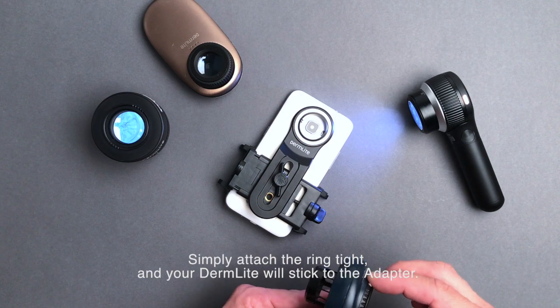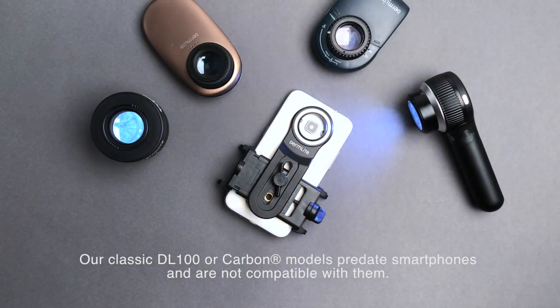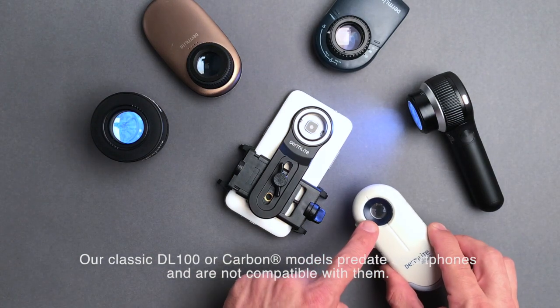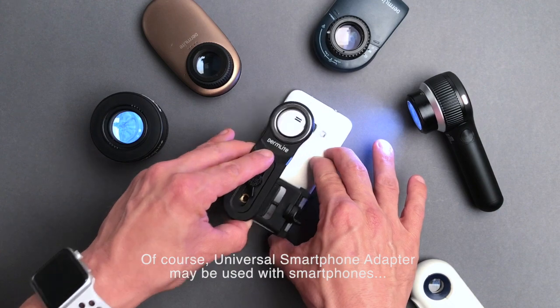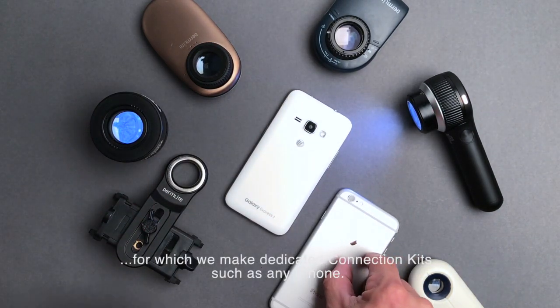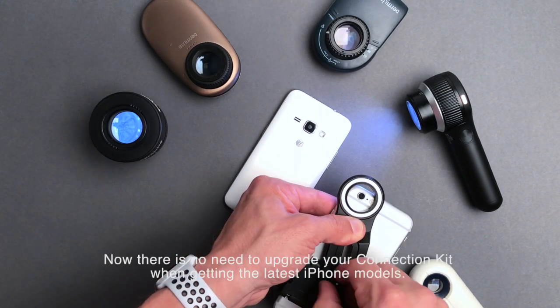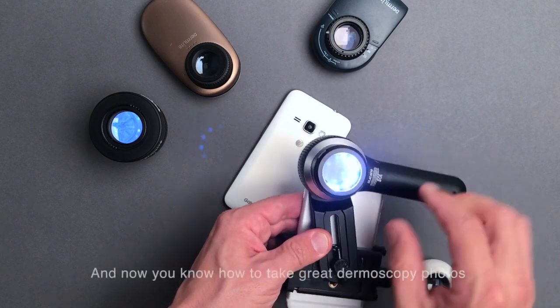Your DermLight will stick to the adapter. Our classic DL100 or Carbon models predate smartphones and are not compatible with them. The Universal Smartphone Adapter may also be used with smartphones for which we make dedicated connection kits, such as any iPhone — there is no need to upgrade your connection kit when getting the latest iPhone models.